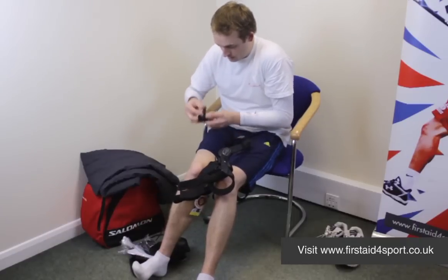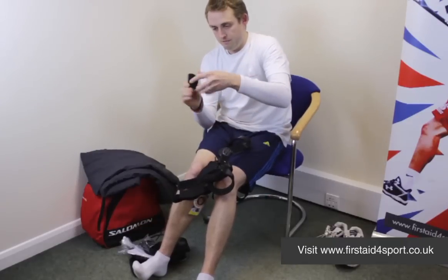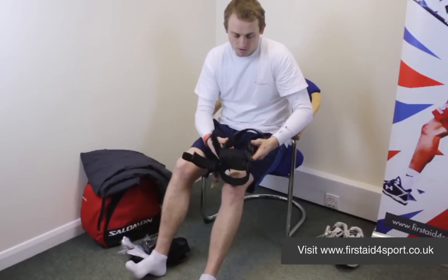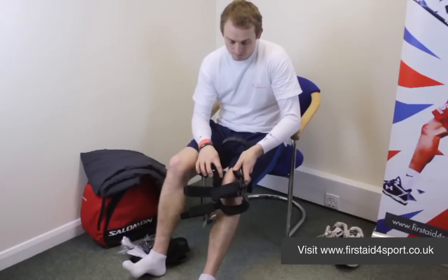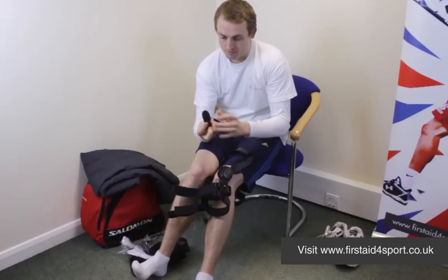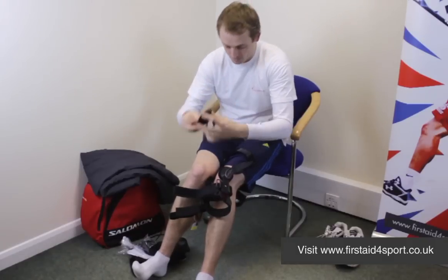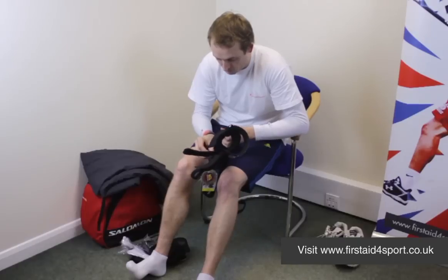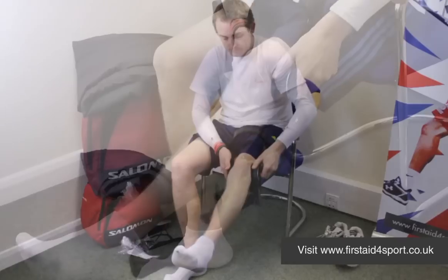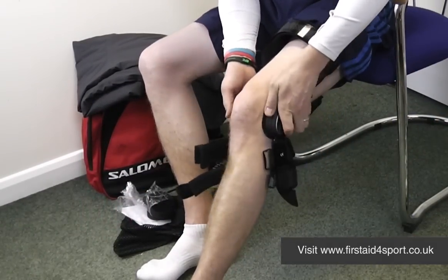Cover this one back up again and simply Velcro it back on. So this brace is for the left-hand side. On the inside of your knee is a special condyle pad called an anti-migration condyle pad. There is a small raise on the top, and this just stops the brace from slipping down your leg. Your foot goes through the brace, you slide it up and then lift it into place.